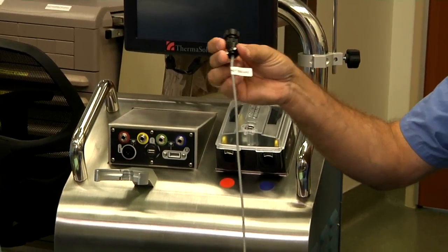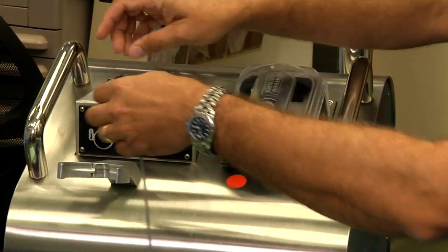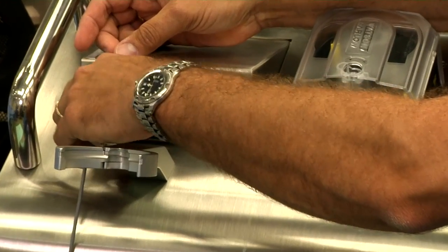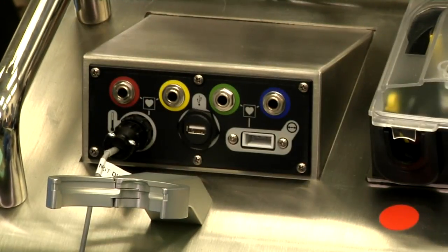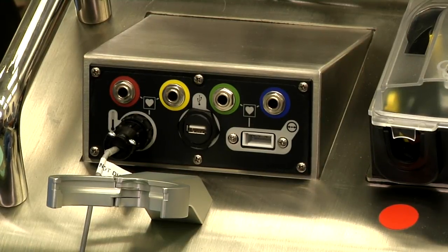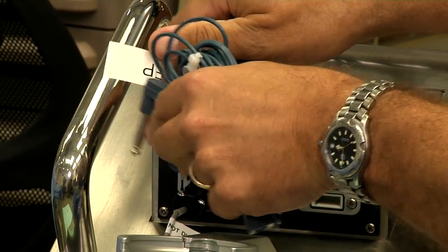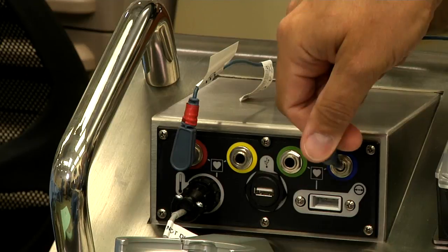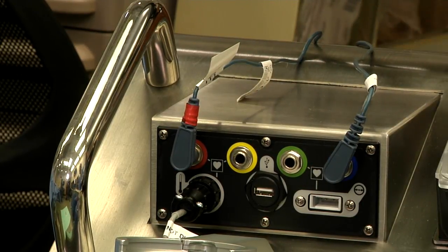There is a gray heat exchange temperature probe that gets placed on the sensor connection panel and is tightened. There are two blue temperature extension cords that get plugged also into the panel, and then we'll move them out of the way towards the back of the device.